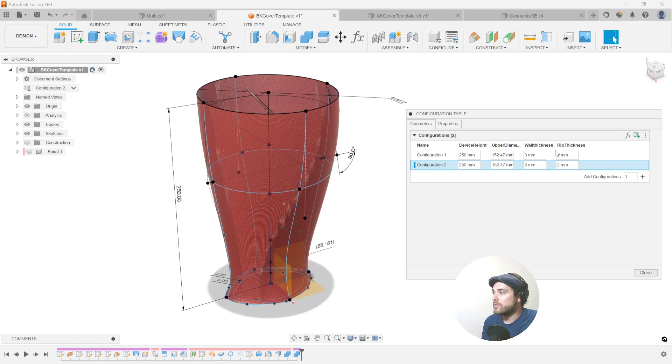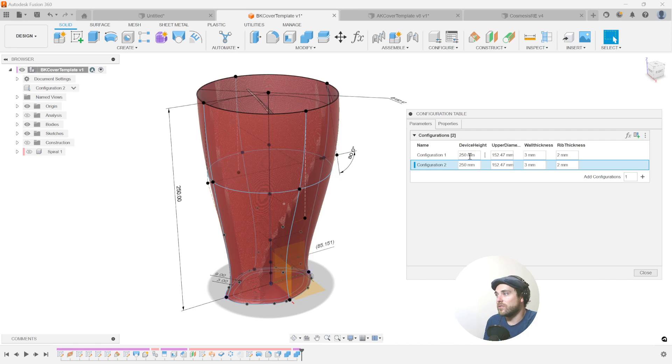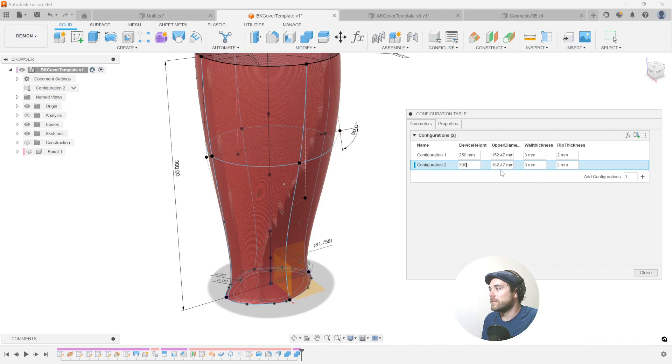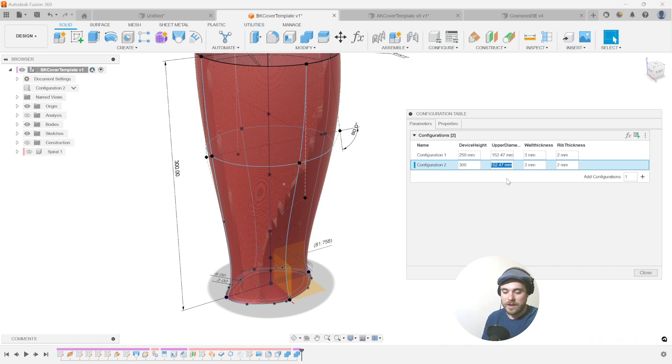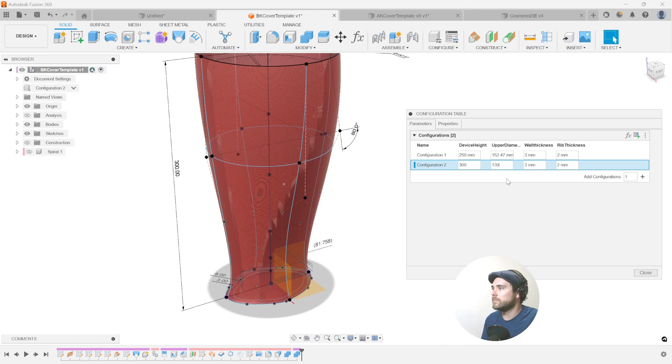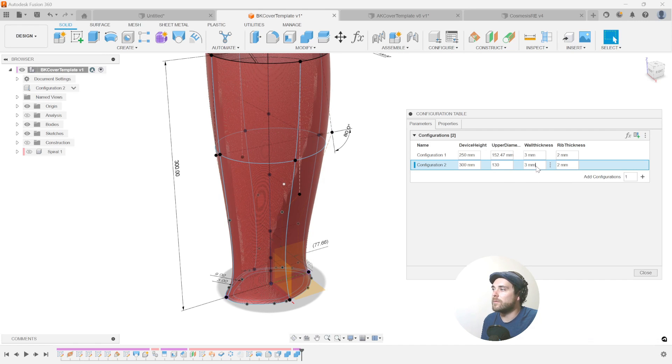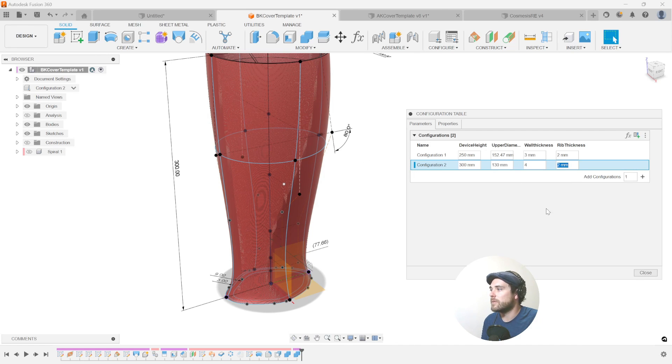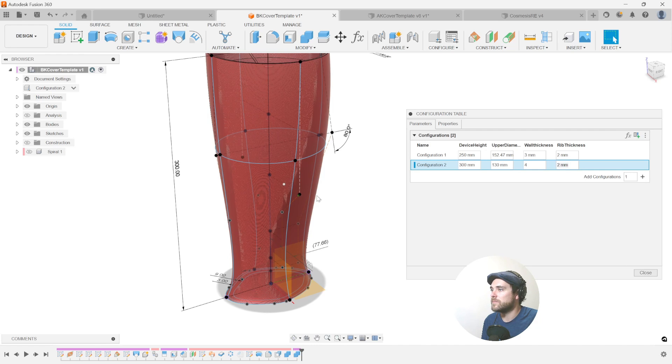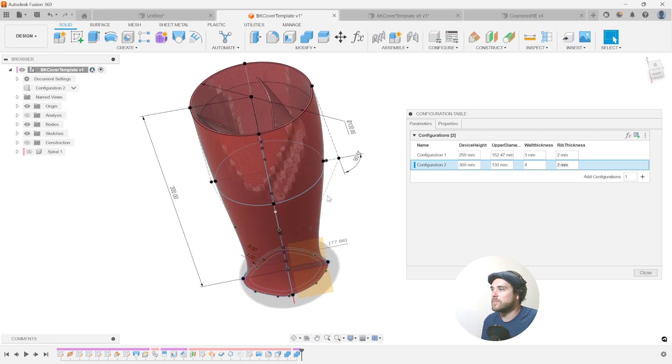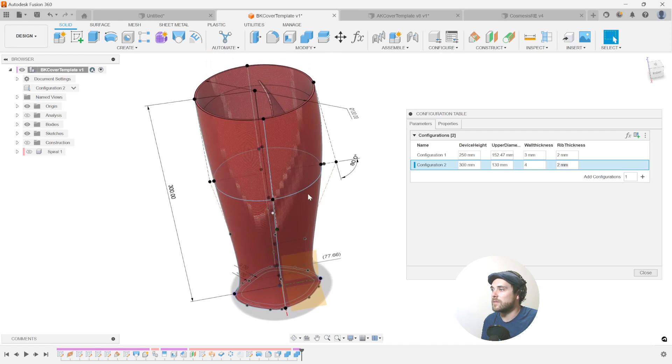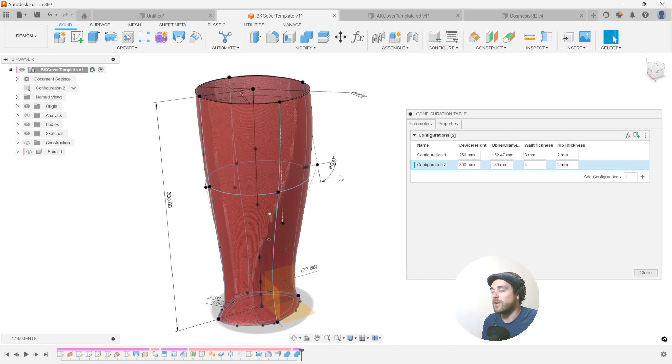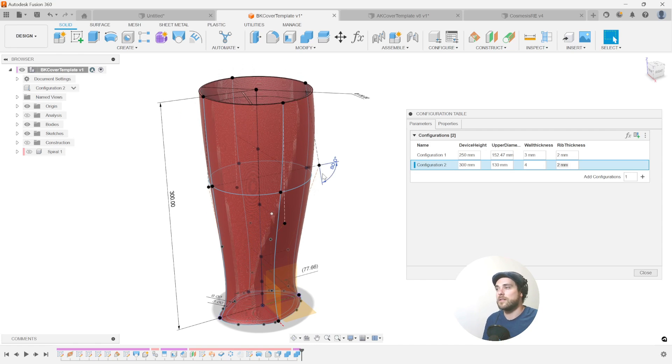So I'm going to add a new configuration now and configuration two is going to carry over all of the different variables from the first that we assigned. And now in configuration two, let's go and change some of these values. So let's change our device height to 300 millimeters tall. Let's change our upper diameter to 130. Our wall thickness, maybe we're printing in TPU and we want a wall thickness of four. So that one's going to have a slightly larger wall thickness and the rib thickness I'm going to leave at two. So that was really easy to program in. We have two configurations in the same file that have all of our values called out.